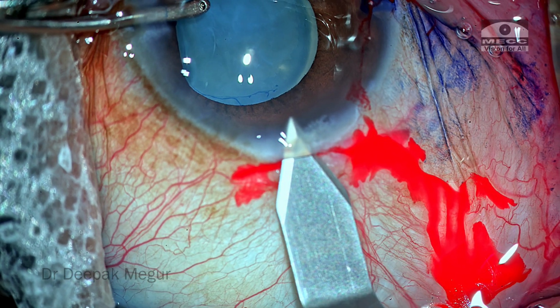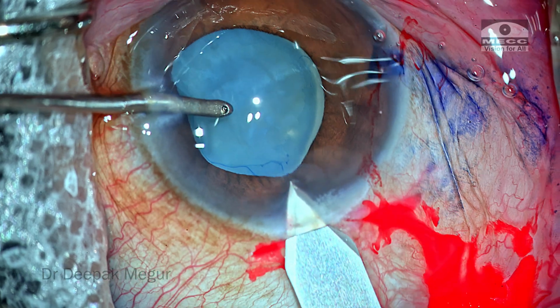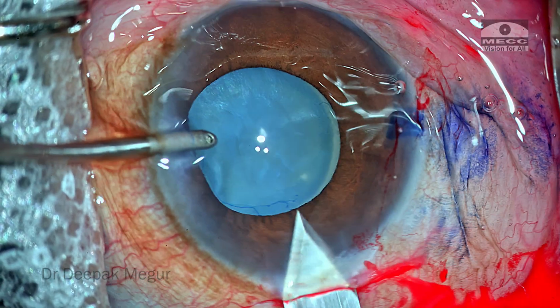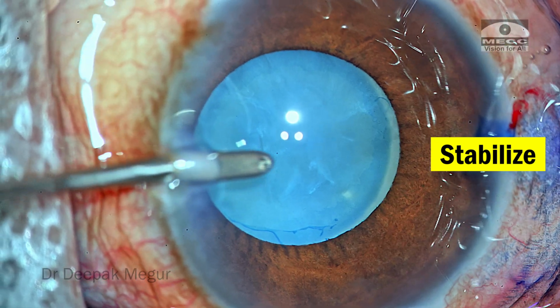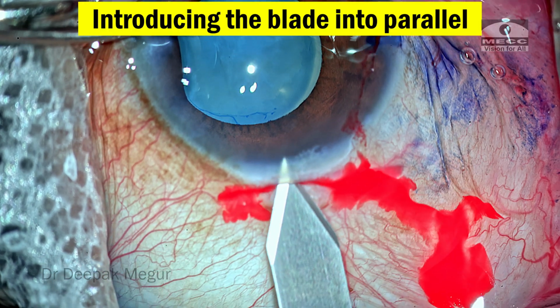So we can see that the blade just goes in, creates a corneal tunnel, perforates the Descemet's membrane, and we're through. So the incision is created. Now, let me break this step into multiple smaller components. First, the globe is stabilized. The eye is turned away from me a little bit. Then the blade is introduced parallelly.